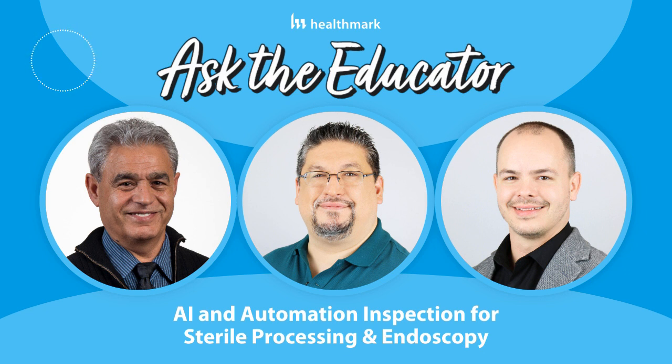So it's amazing that when you look at that, you don't have to look at what it does. If you're busy, you can just push it through at the speed that you want, and then the report comes out to the management, and by the serial number you can go back and look at it to see if there's anything wrong.